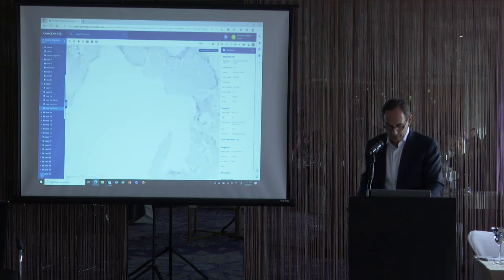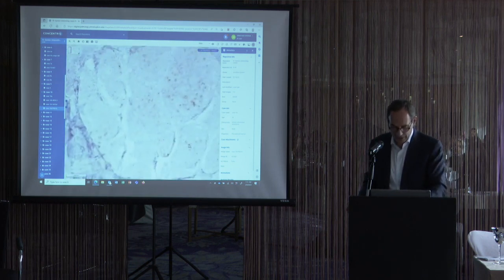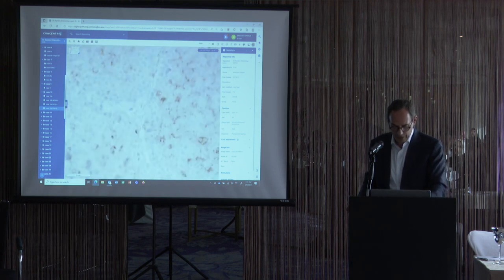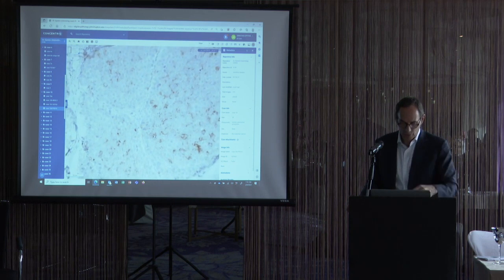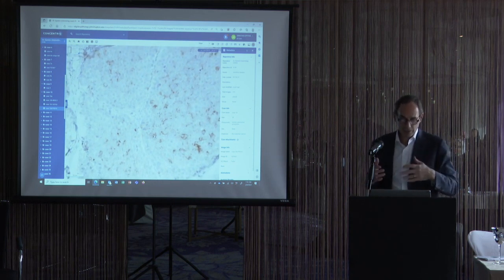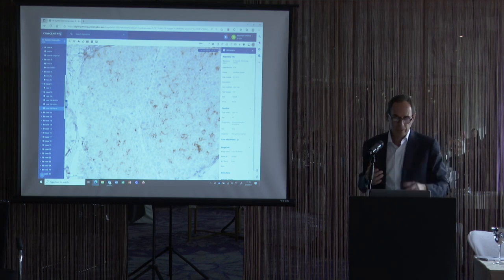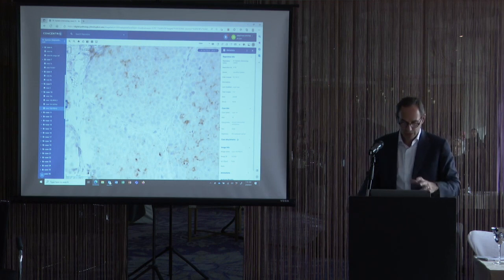I like it as a prostate marker because it has very distinctive staining: clumpy, granular staining in the cytoplasm. Sometimes with cytoplasmic staining you can get some non-specific blush, but with P501S, this clumpy staining tells you it's real. So no question it's prostate cancer. NKX is positive, P501S is positive, morphology is positive.